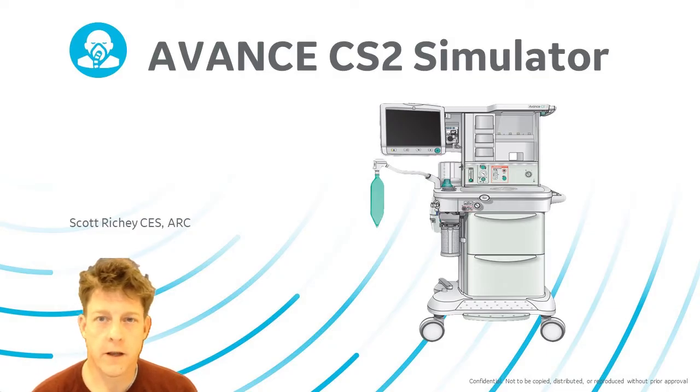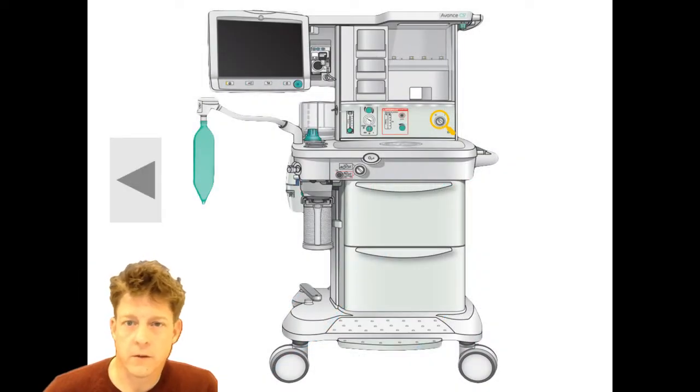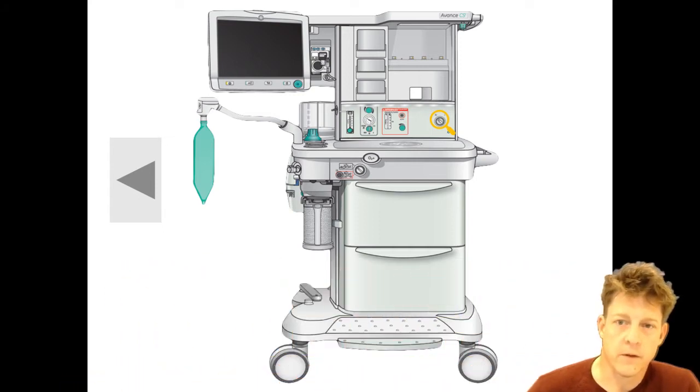I am a clinical education specialist with anesthesia and respiratory care, and in this video I will be demonstrating how to use the AVANCE CS2 Simulator. What I'm going to do now is share my screen, and when you first start the simulator itself, it's going to go through a couple of introductory screens, and you're going to come to this view right here. I'm just going to move over this right side of the screen so you can see it.